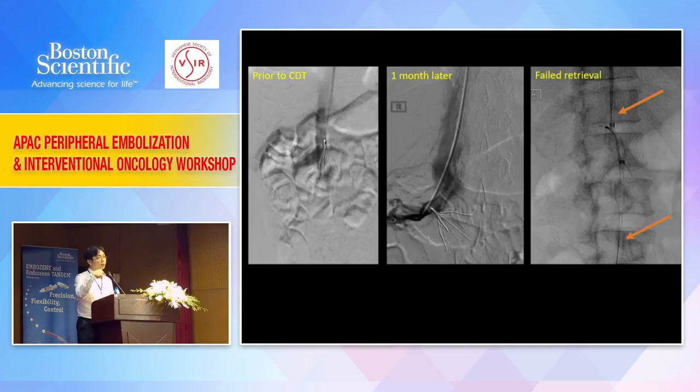So when he went back to Bali, he didn't listen to our advice to stop physical activity for at least a month or 2 months. Immediately when he went back, he felt better with his leg swelling better. He started to go back to his physical activities. Everything moved, as you can see very clearly, that the tip of the filter has tilted now into the right renal vein. And when we tried to snare it for about 2 hours, of course that didn't work. And then in the end you snare, and you never ever pull the filter out this way, which is on the right-hand side.